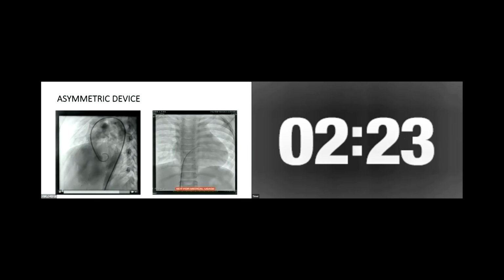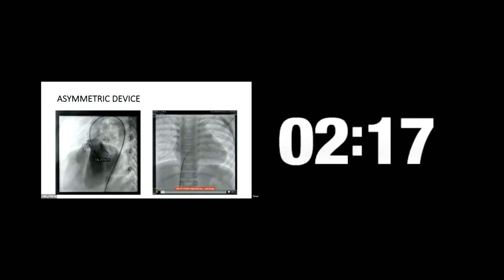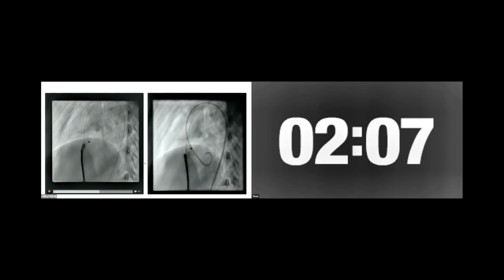There is a multiple fenestration just below the aortic valve, also with some separation. RV crossing done. Fortunately, this we can close any defect, any smaller defect also, because we are going to put a VSD occluder with a larger disc on the LV side, and we just kept a buddy wire for the recrossing.